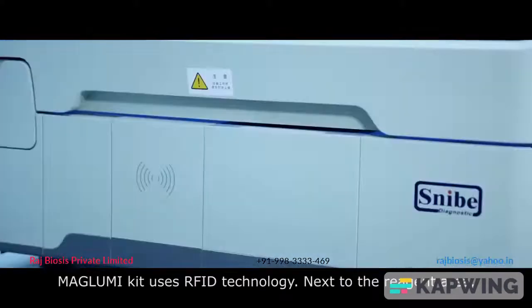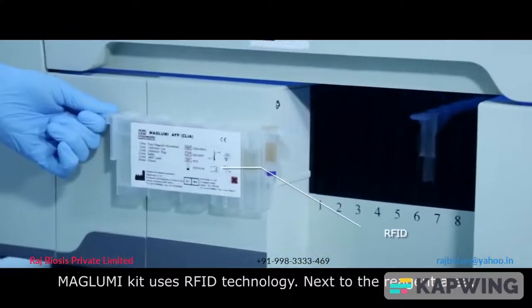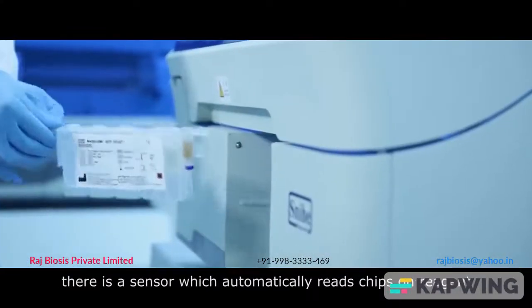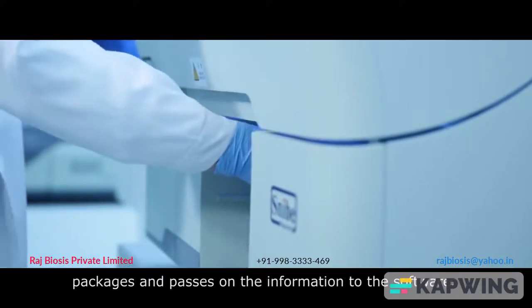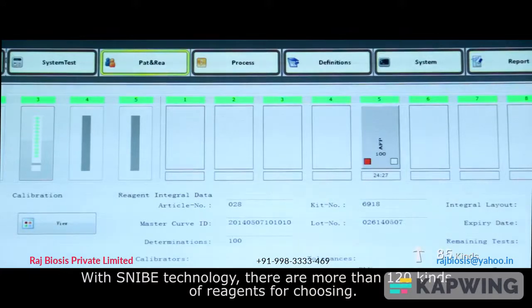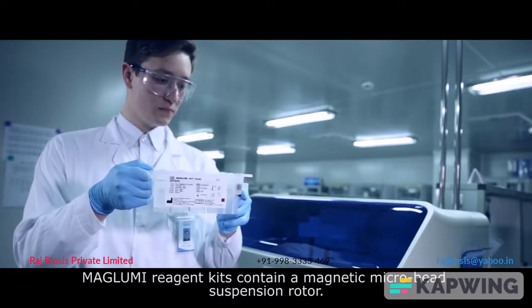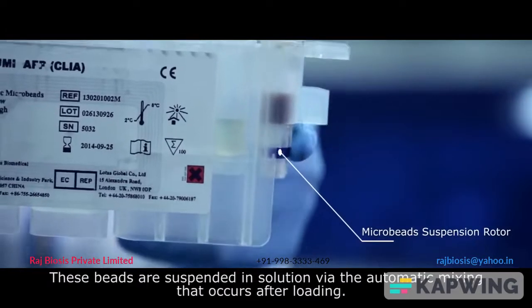The Maglubi kit uses RFID technology. Next to the reagent area there is a sensor which automatically reads chips on reagent packages and passes all the information to the software. With Snipey technology there are more than 120 kinds of reagents to choose from. Maglubi reagent kits contain a magnetic microbead suspension; these beads are suspended in solution by automatic mixing that occurs after loading.